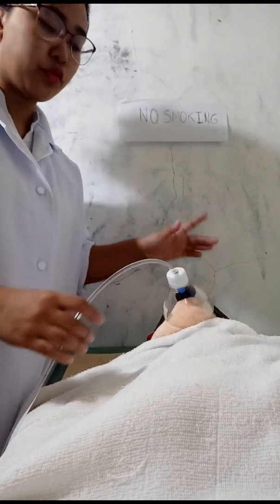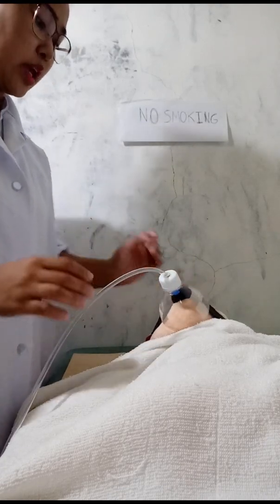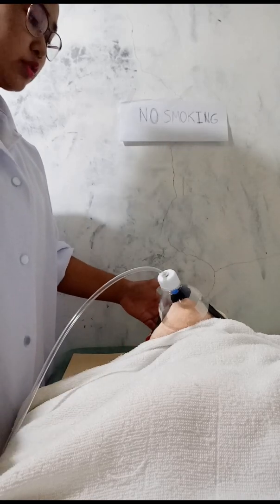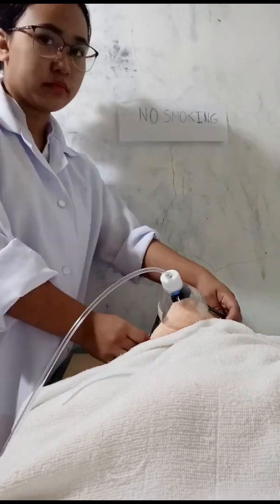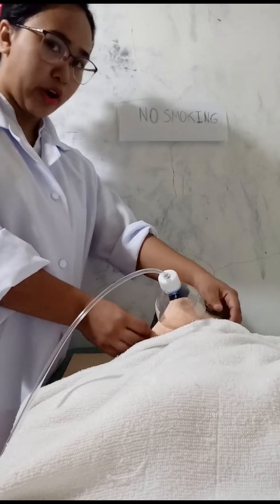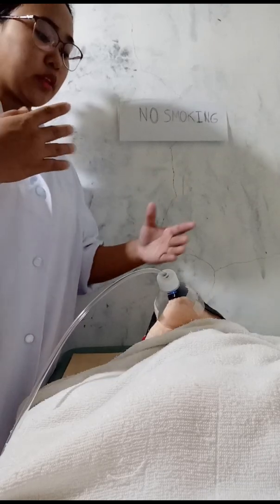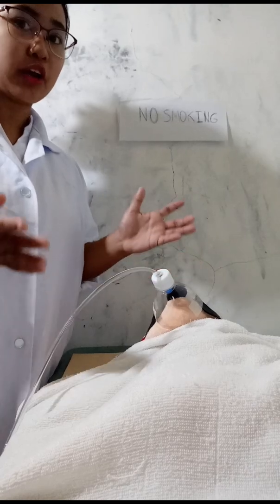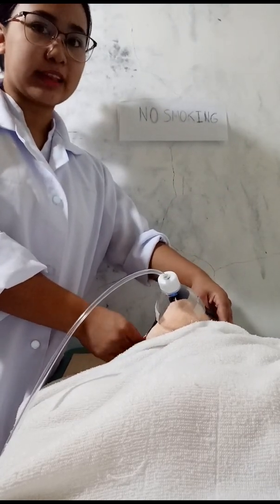Then, make sure natin na yung pinaka-tube niya is nakababa. Okay po ma'am, try po natin na i-close yung mouth natin and then hinga po tayo sa nose lang po. Nahihirapan po ba kayong huminga? Na-irritate po ba kayo dito? Hindi naman po. Okay po. Then after 8 hours, we need to check the patient if okay pa yung tubing, nakakahinga yung pasyente, and kung merong irritation sa skin ng patient natin.